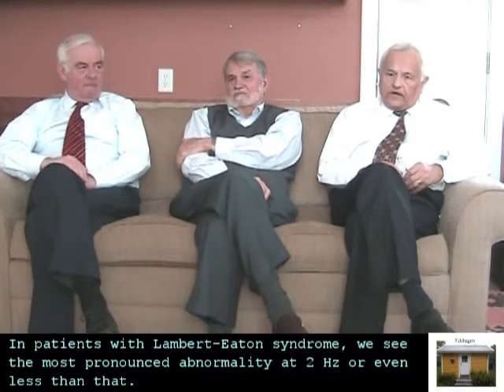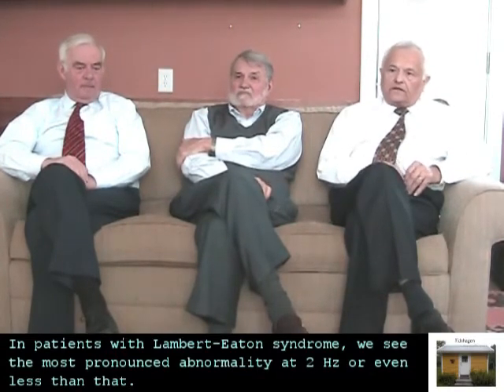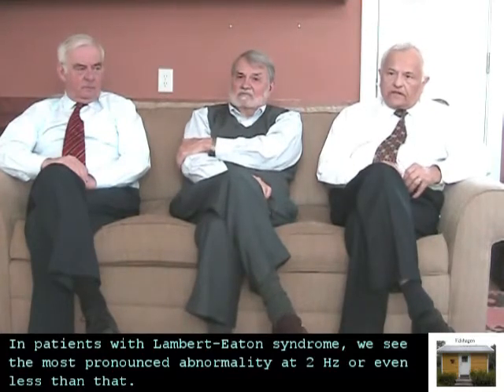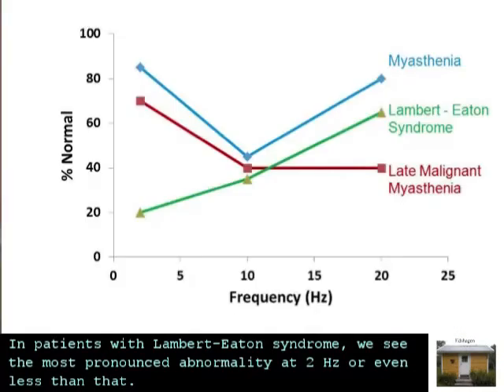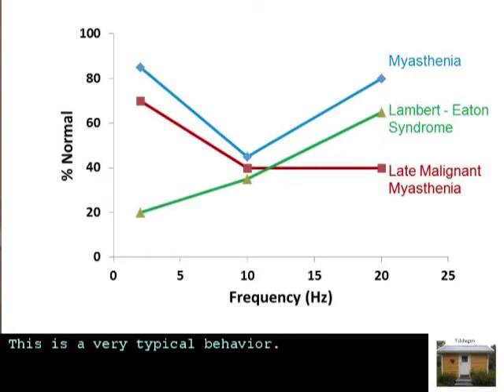Well, in patients with Lambert-Eaton syndrome, we see the most pronounced abnormality at 2 Hertz, or even less than that. And then slight improvement at 5 Hertz, more improvement at 10 Hertz, and perhaps normalization of jitter and complete cessation of blocking at 30 or even 50 Hertz. This is a very typical behavior.